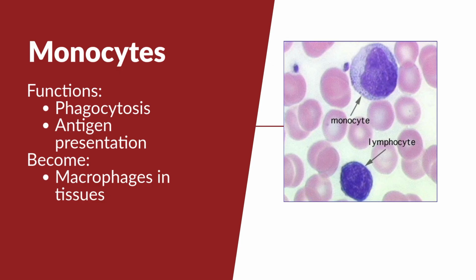Vacuoles may suggest active infection, inflammation, or cellular digestion activity, and monocytes have a high yield. Increased monocytes may be seen in chronic infections, tuberculosis, recovery from some type of infection, and some type of inflammatory disorder. There is a leukemia associated with monos. Monocytes often increase during recovery from acute infections. This can appear after neutrophils begin decreasing.